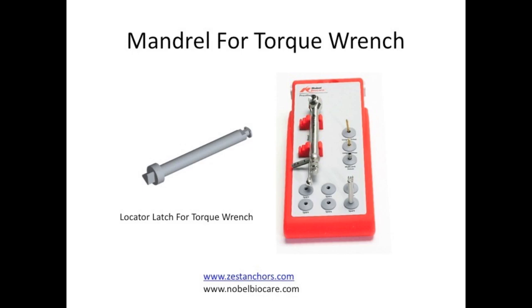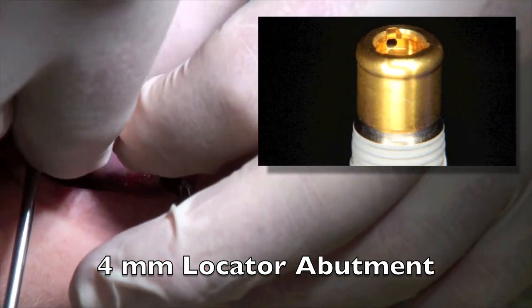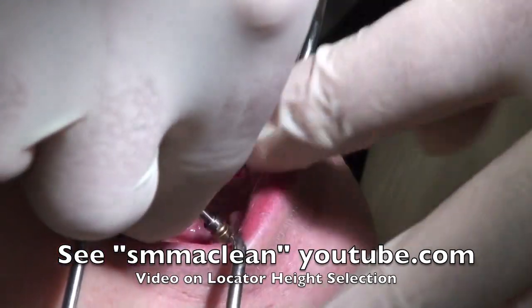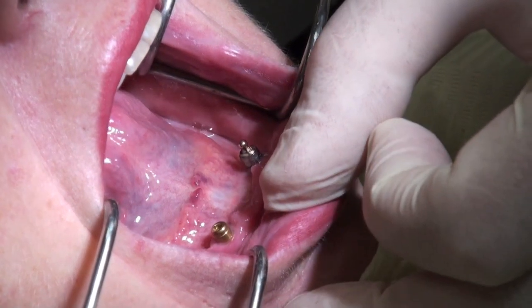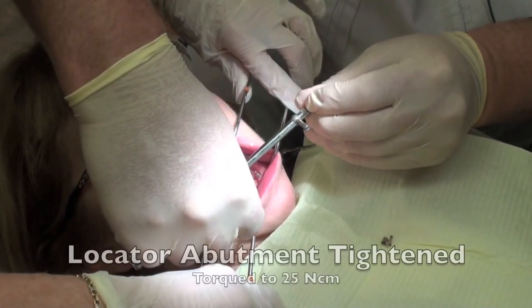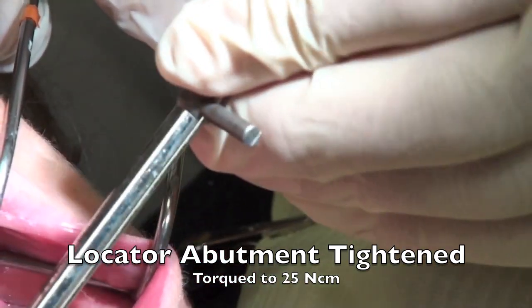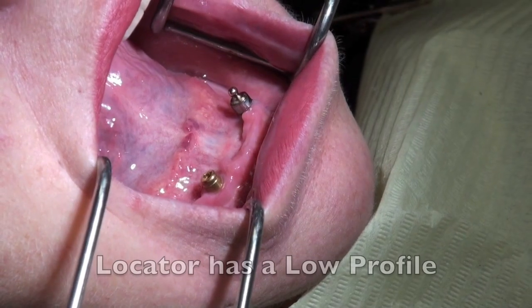We use a locator mandrel, which is a latch that goes into the torque wrench, and this enables us to put the locator on. To pick locators, one thing you can do is go to my YouTube video — if you type in SM McLean you'll find that. Once the locator is tightened down with this mandrel, we're going to make sure it's sitting about one millimeter above the tissue once the cap is on. You can try the cap on to confirm this, and then we tighten the abutment down to approximately 25 newton-centimeters to make sure it's stable for the attachment to be picked up in the denture.